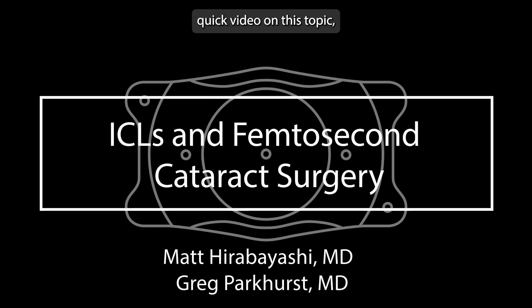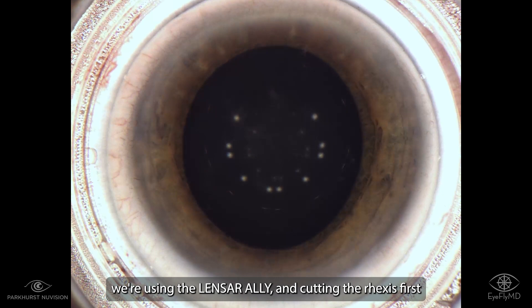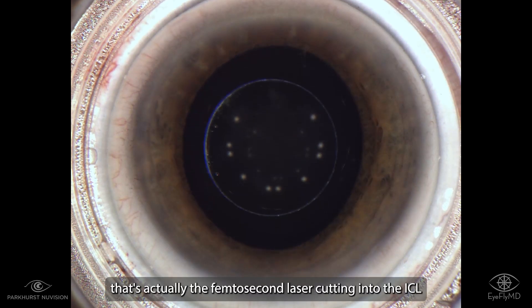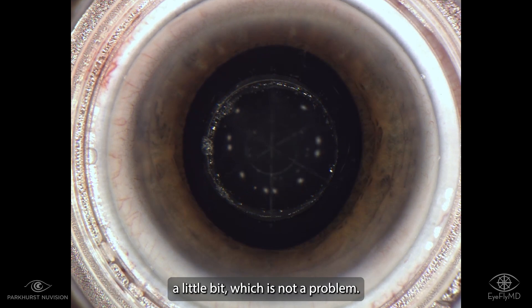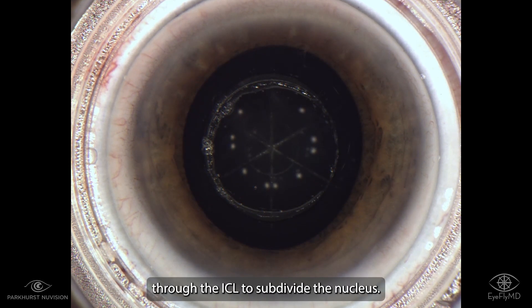I wanted to make another quick video on this topic, just again to show how easy this process is. Here we're using the LENSAR ALLY and cutting the rhexis first, and you'll see that bright flash — that's actually the femtosecond laser cutting into the ICL a little bit, which is not a problem, and then it easily penetrates through the ICL to subdivide the nucleus.